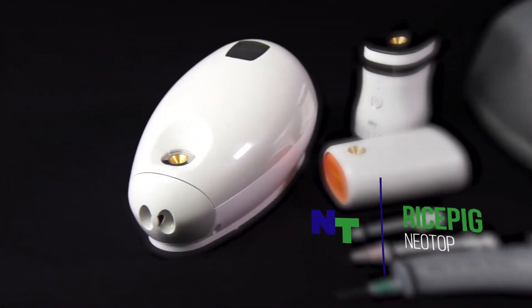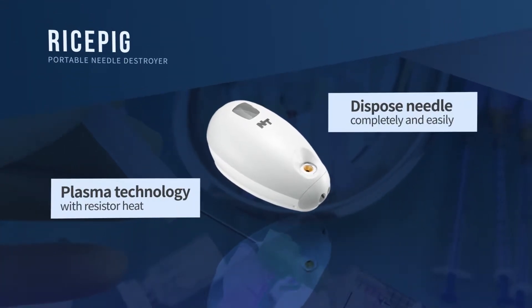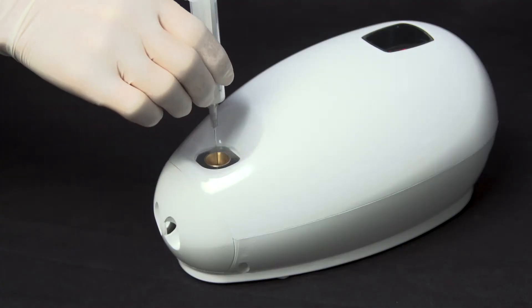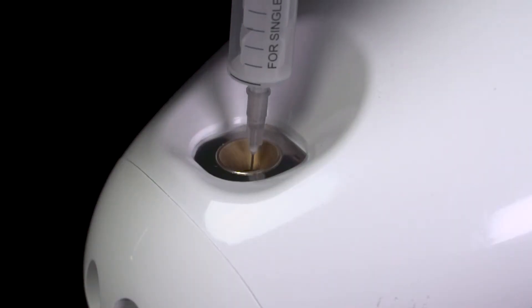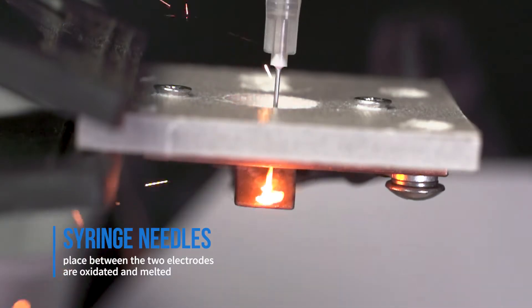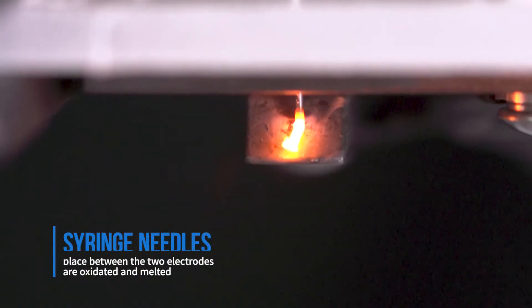RicePig utilizes plasma technology with resistor heat to quickly process used syringe needles safely. It is powered by a low DC current from a rechargeable battery and syringe needles placed between the two electrodes are oxidated and melted.